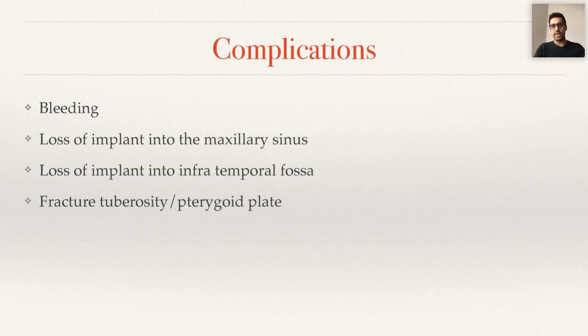In the second video you saw me placing the implant fixture. The right pterygoid was going in, it was a BioHorizons. That particular implant was a 3.8 by 15, and you saw that gold 3-in-1 abutment. I feel that video nicely illustrates how you can get good torque. It torques out at 42 newtons, and then I take off the handpiece and use the surgical hand driver just to seat that implant into the correct position in the bone, and the torque would only be going higher after that. Then I'd take off that 3-in-1 abutment. You can certainly get really good torque values with pterygoid implants, allowing you to utilize them for immediate load. Okay, so let's go on to complications.